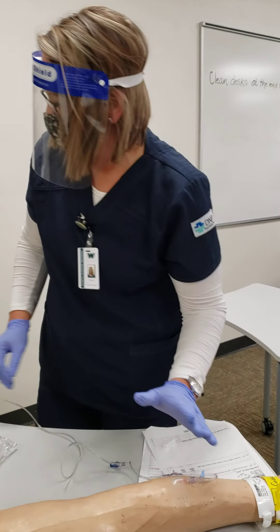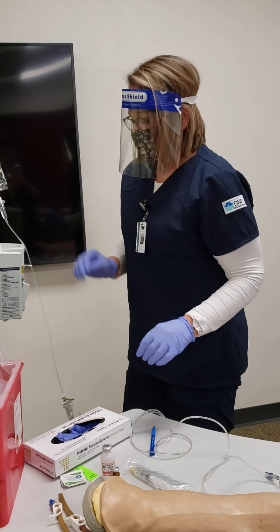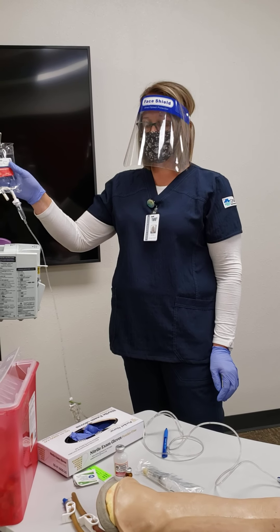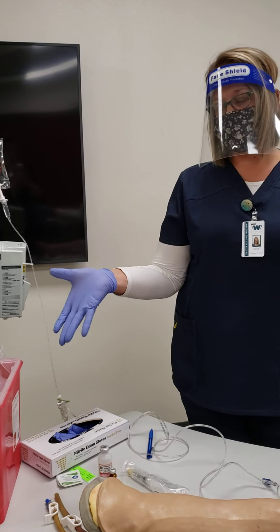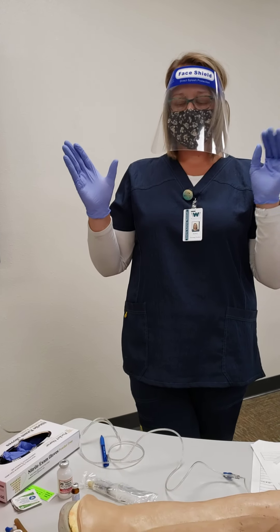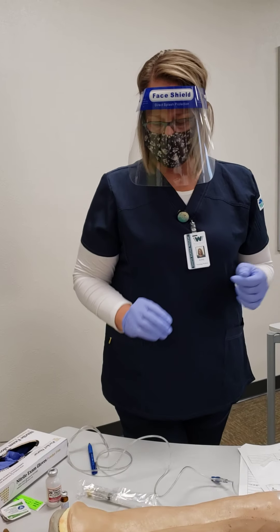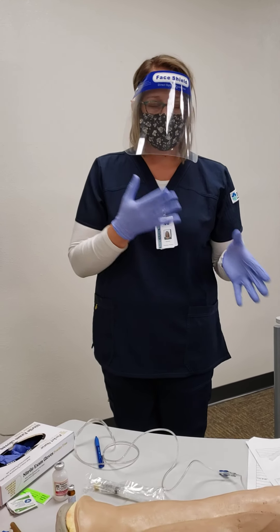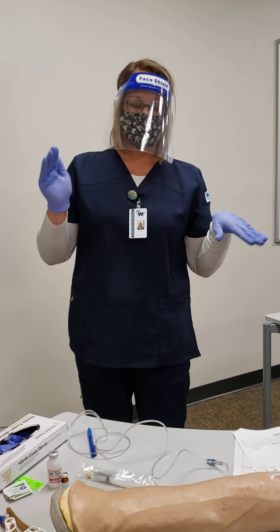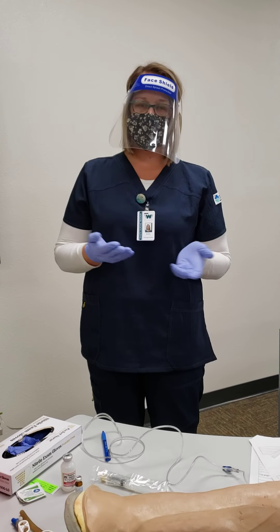Everything is connected, there are no bubbles. We turn the pump on and set it up for potassium chloride at 125 milliliters per hour with a total of 250 milliliters infusing. Before discarding the morphine sulfate needle into the sharps container, I would verify with a second nurse to make sure it was disposed of properly. Then I'd take off my gloves, do hand hygiene, complete documentation, make sure Shirley didn't need anything, and that everything was working correctly. I'd be checking on her every 15 to 20 minutes after giving the morphine to check her pain and make sure she doesn't have any respiratory depression.